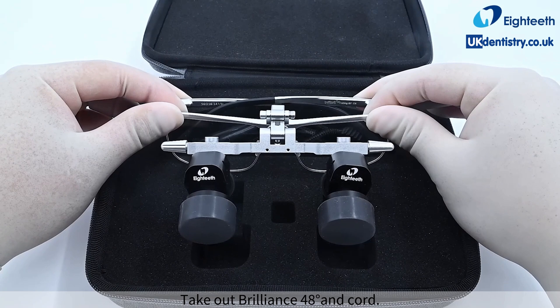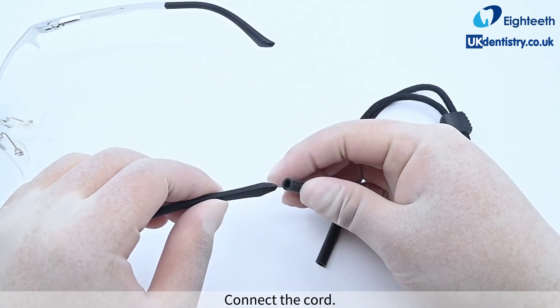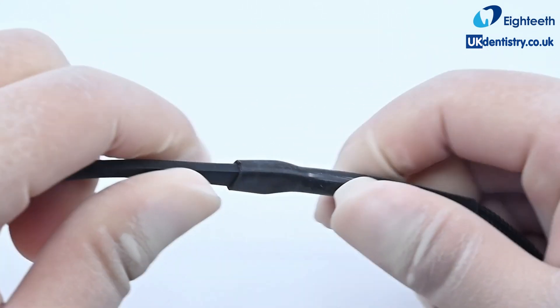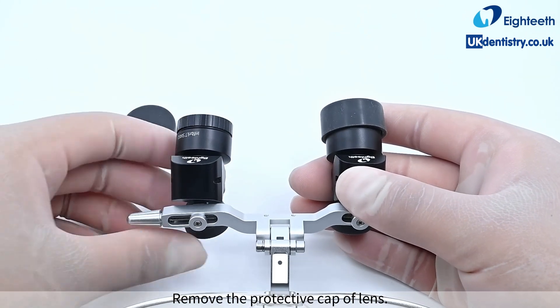Take out the Brilliance 48 degree and cord. Connect the cord. Remove the protective cap of the lens.